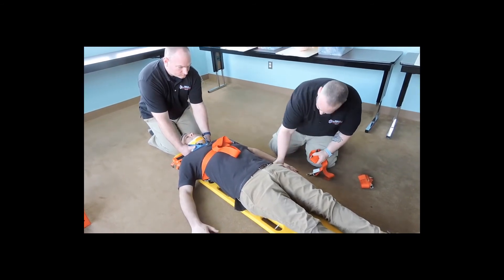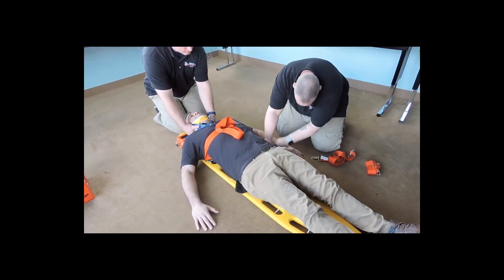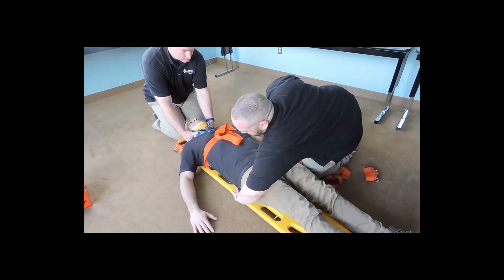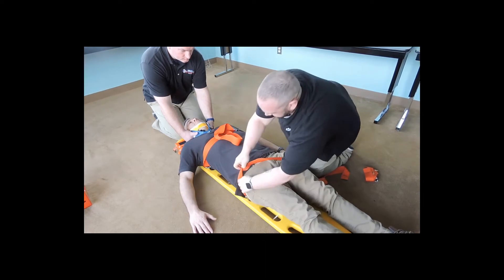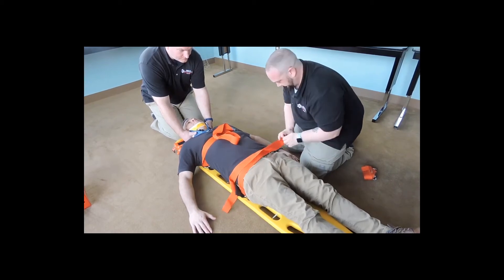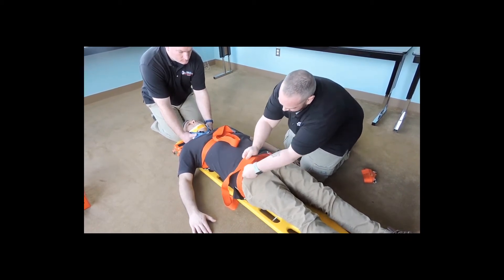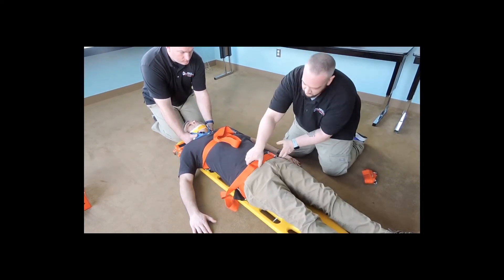Our second strap we're going to use to immobilize the pelvis — right over where the belt would lie, so we're immobilizing the pelvic bone. We secure our strap using the feeding method, making sure that we're on the bone and not going over soft tissue in the abdomen. Again, we would be padding this buckle that's against the skin.